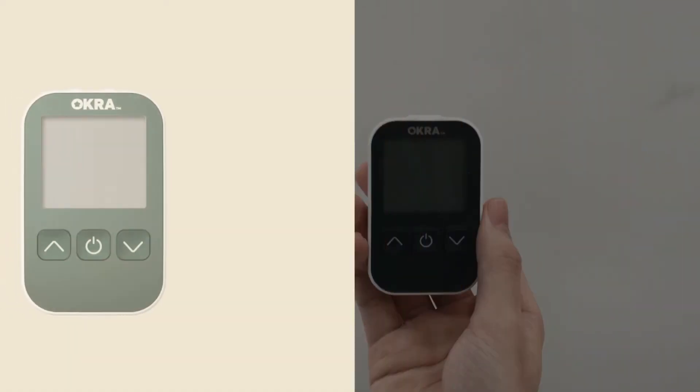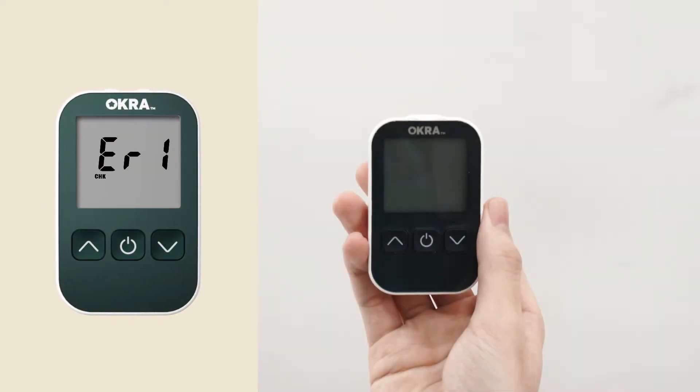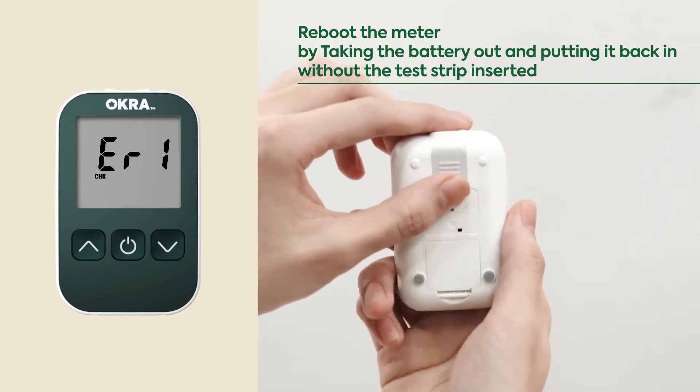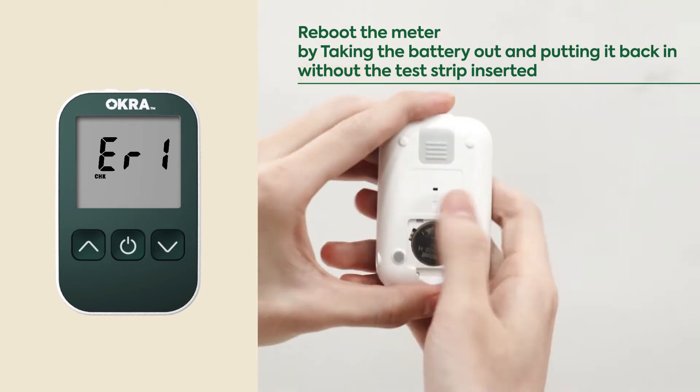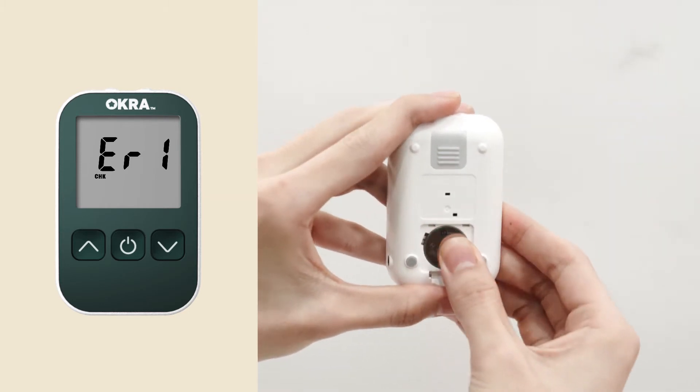Thank you for choosing the Okra meter. We will go over the cause and solution of the errors on your meter. Reboot the meter by taking the battery out and putting it back in, without the test strip inserted. Please contact customer support if the problem persists.